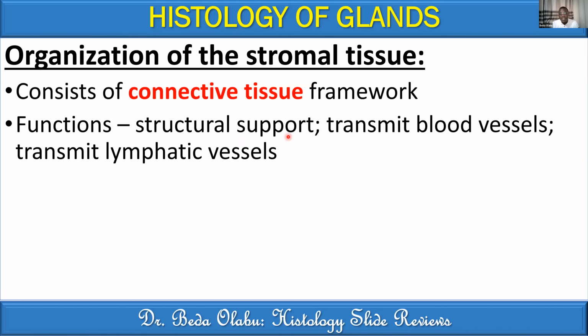But these connective tissue components also are important in transmission of blood vessels, whether they are arterioles or capillaries. They run through these connective tissue elements.